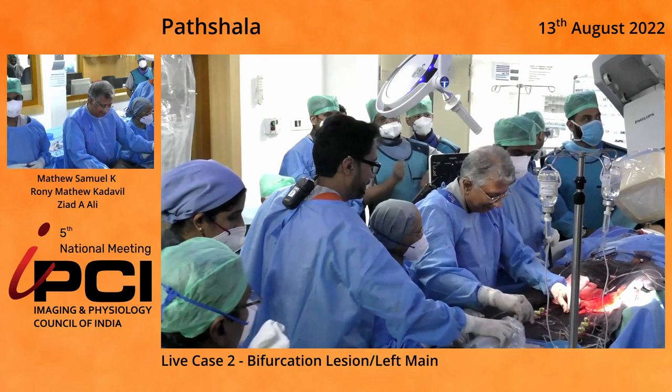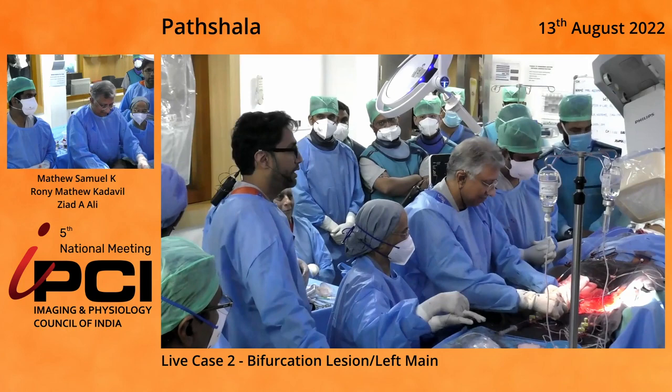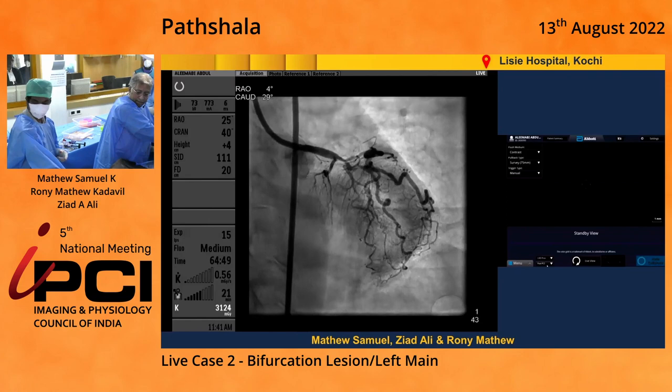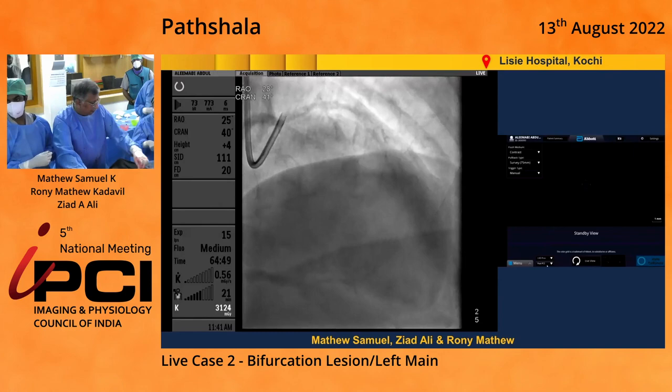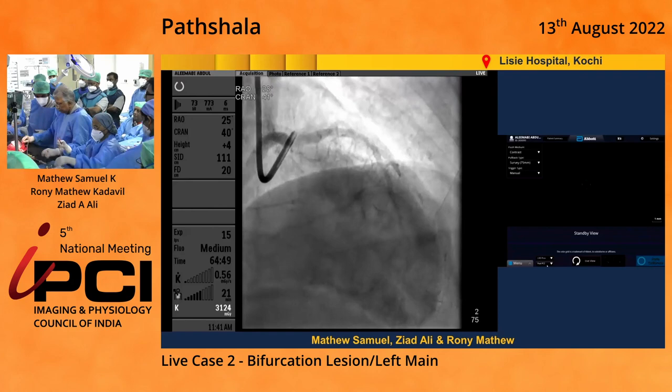This is Ajit Menon. You have about 10 minutes to pull us through the case. So let me walk you through our angiogram first. This is the patient. You can see there's a tight proximal LAD lesion, large first diagonal. This is the apicranial view, again showing a proximal LAD lesion, a large wraparound left anterior descending.